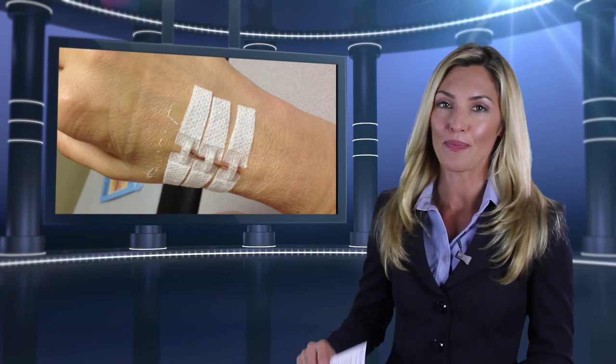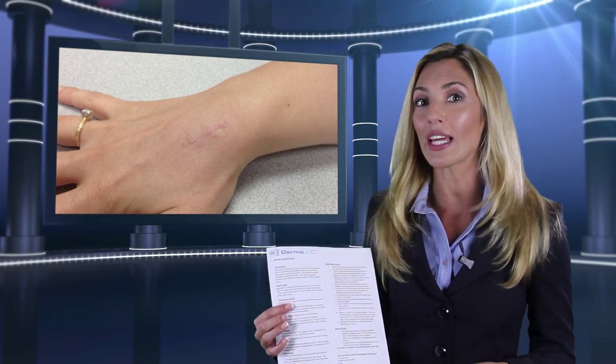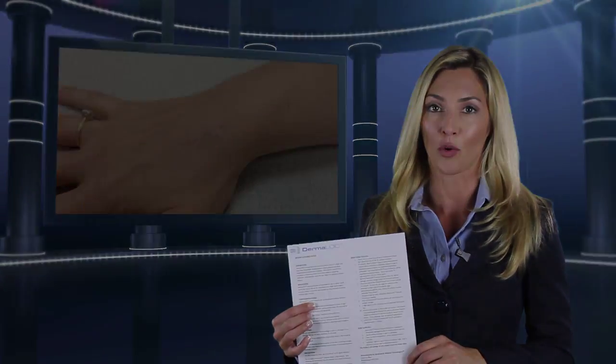Dermalock is easy to use. An easy instruction sheet comes with the product and there is also an online video available to assist you in using Dermalock correctly.